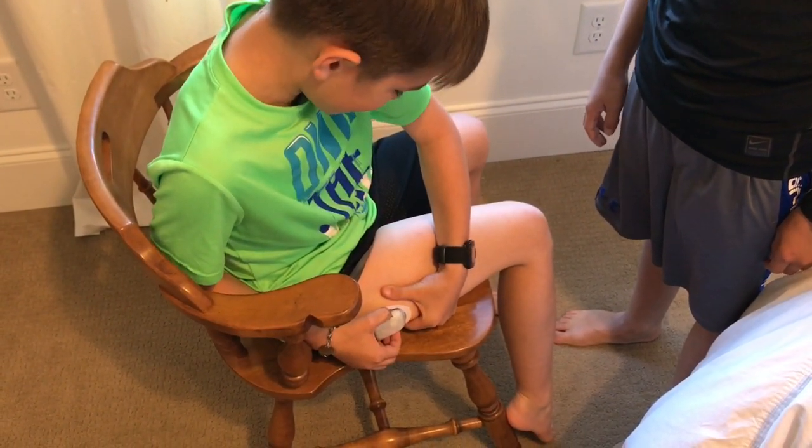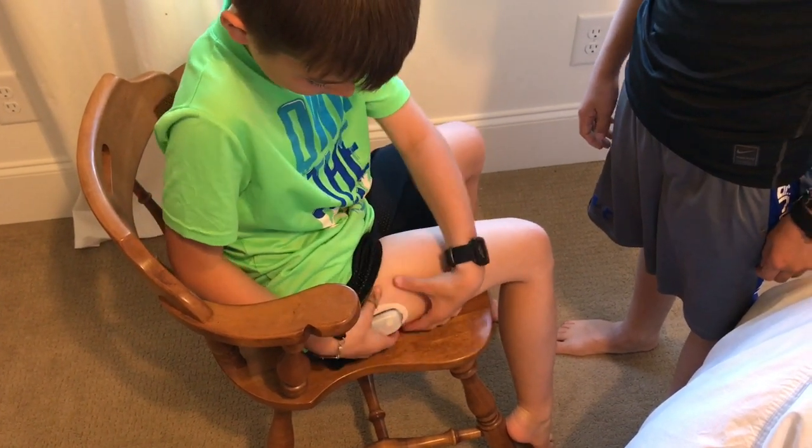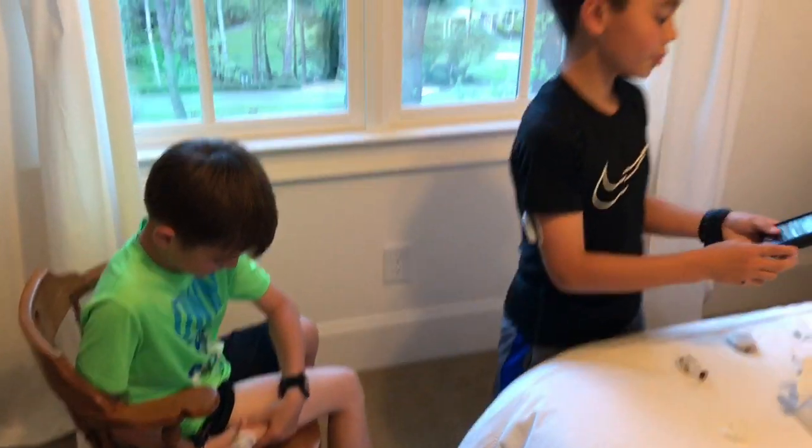Now I'm putting it on the fatty part where I want it. Hit start.